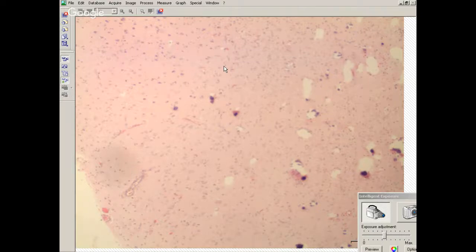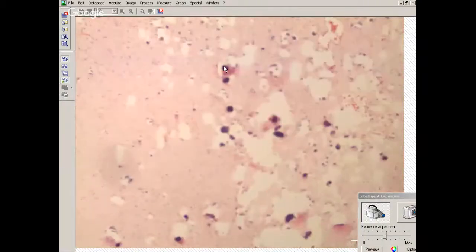The only time I've seen a lot of mitoses or necrosis is when there was a previous resection of the tumor a few weeks previously, and they went back and did a second resection for more of the bulky tumor. They had a two-staged approach because it was so massive. These typically are in young adults or kids, but you have to at least think about it.